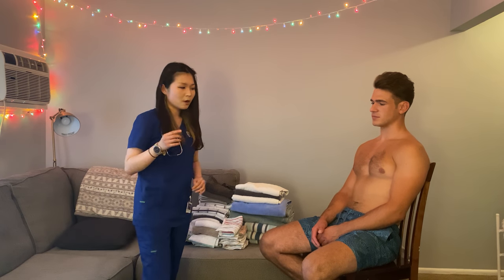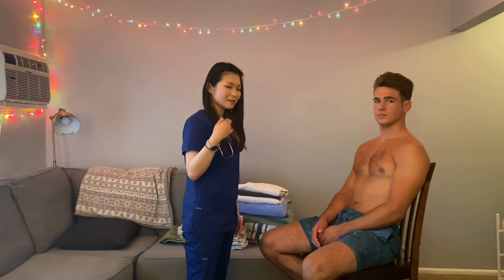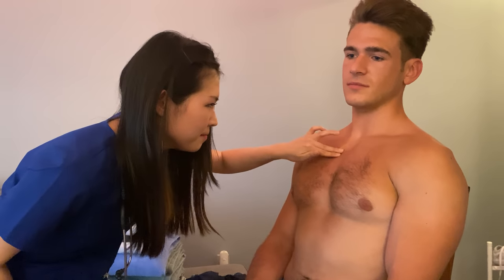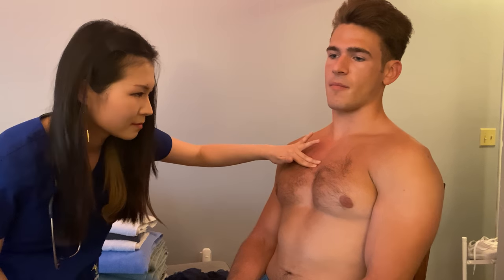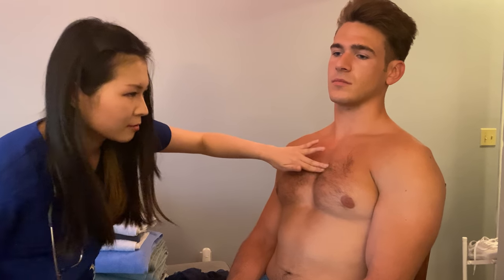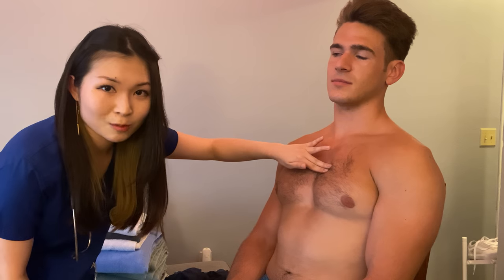Before I do that, I'm going to show you where I'm going to auscultate. So first, I'm going to locate the second rib. This is the second intercostal space, and that is the aortic region, in the right sternal border. And then I'm going to move right across and look for the second rib on the other side. Here is the second intercostal space on the left sternal border, and this is the pulmonic or pulmonary area.